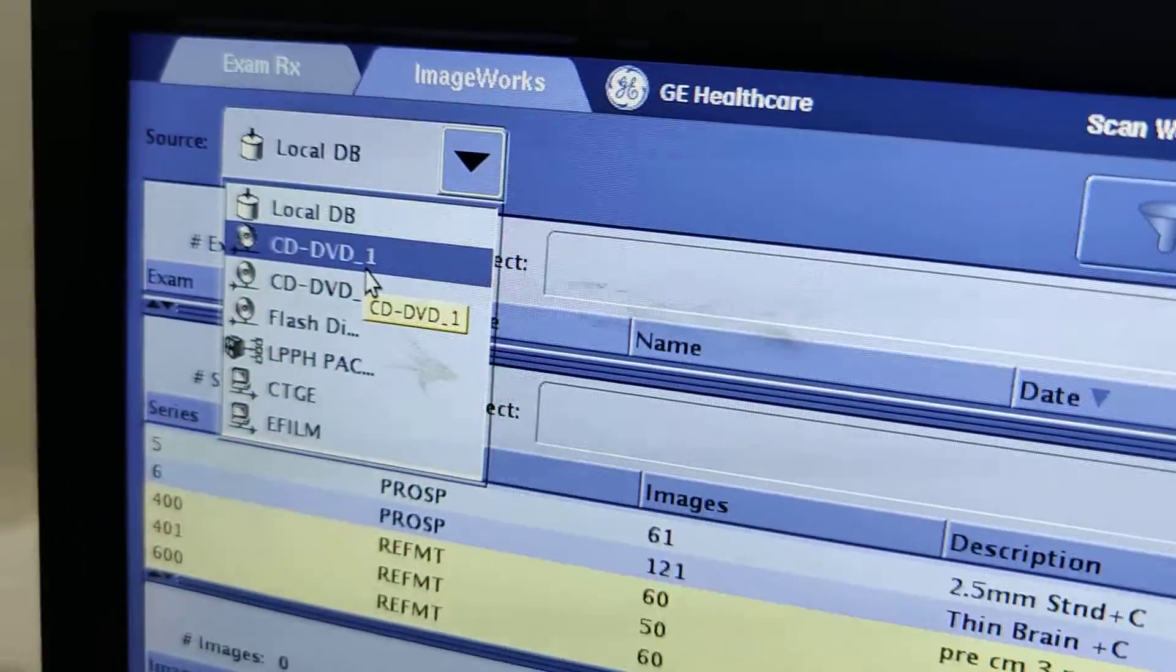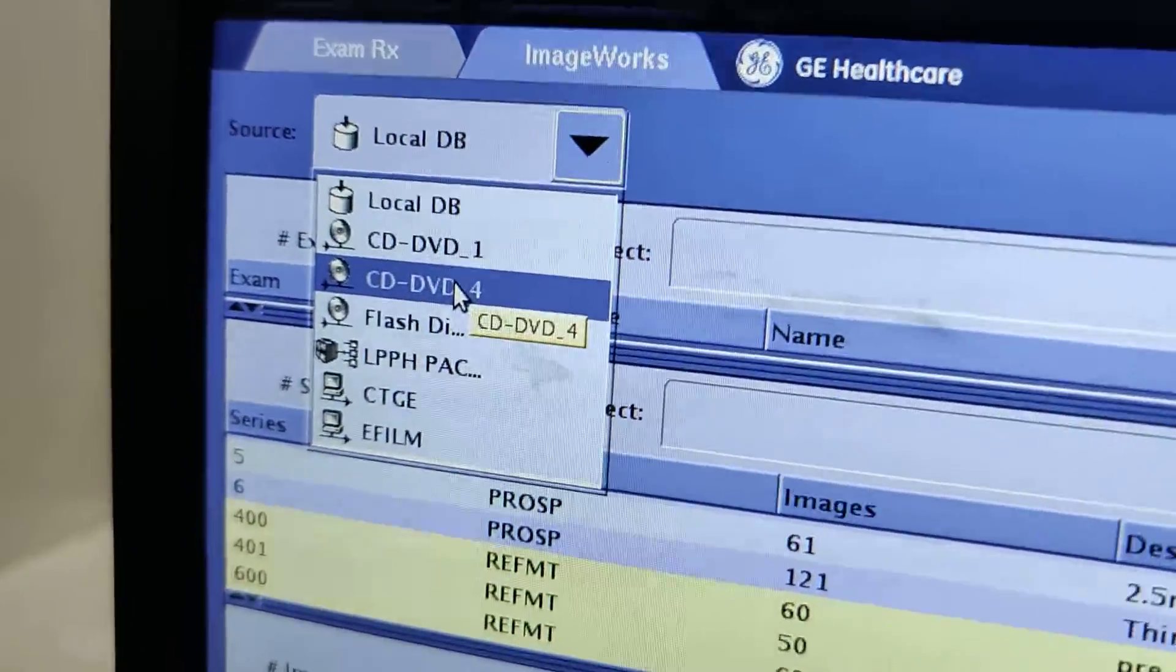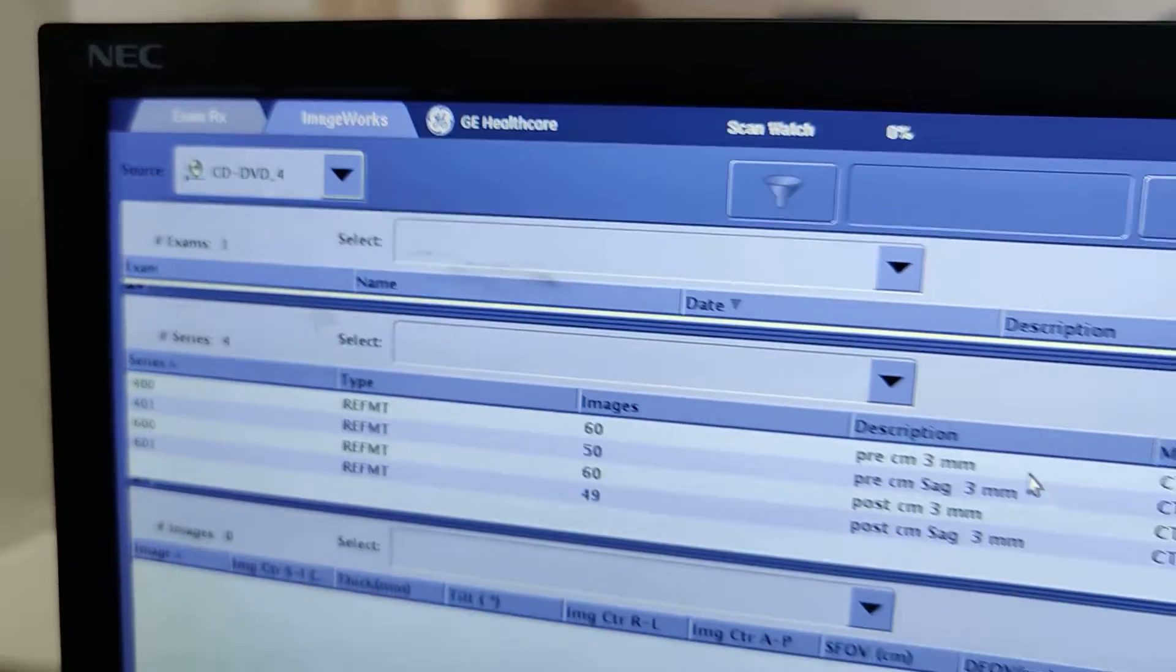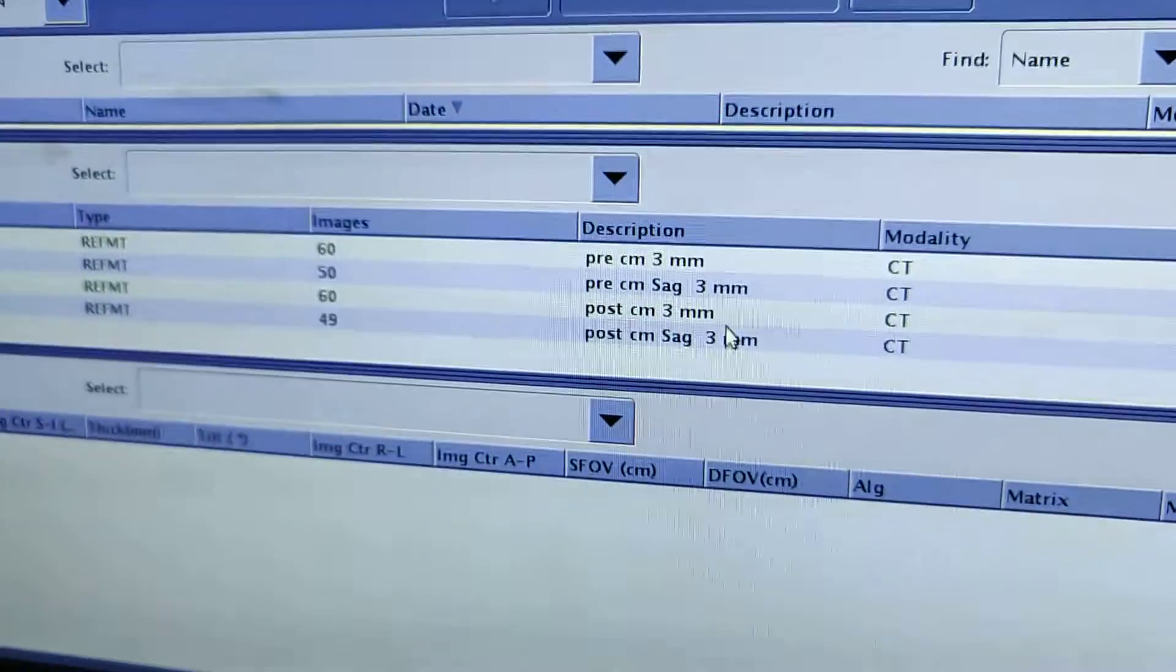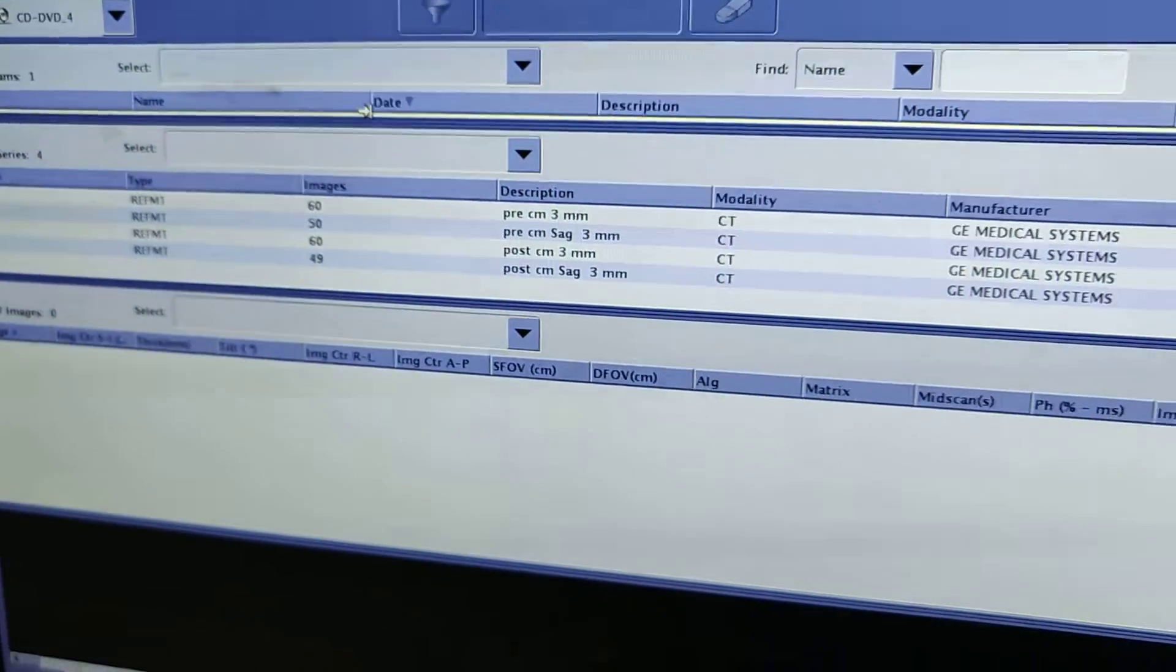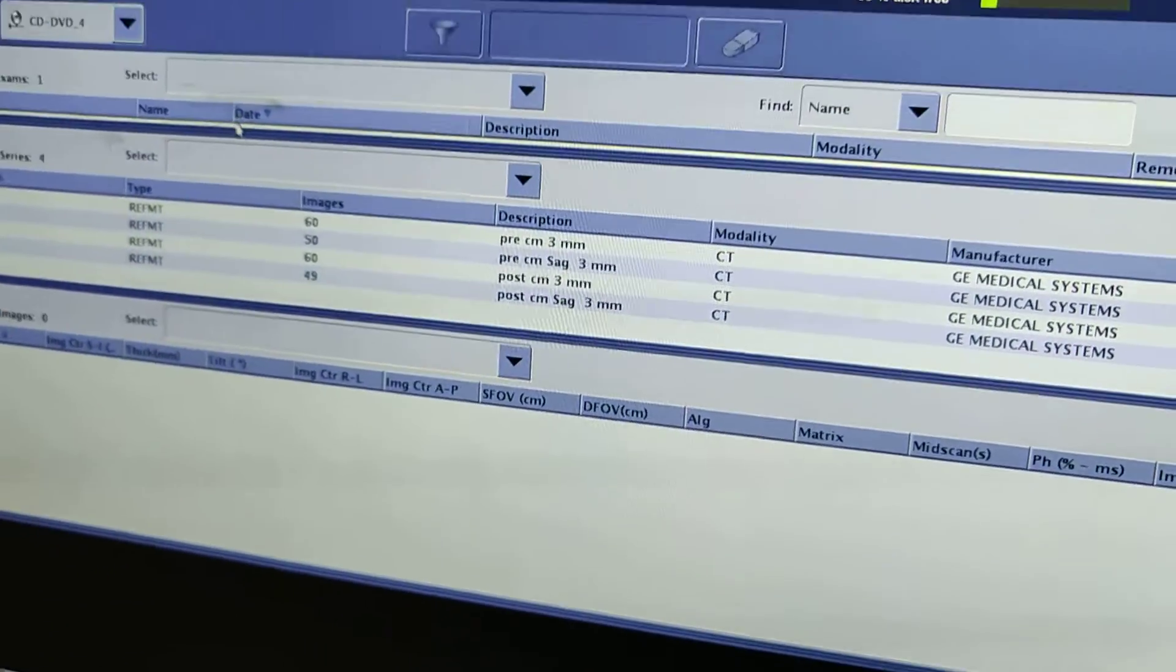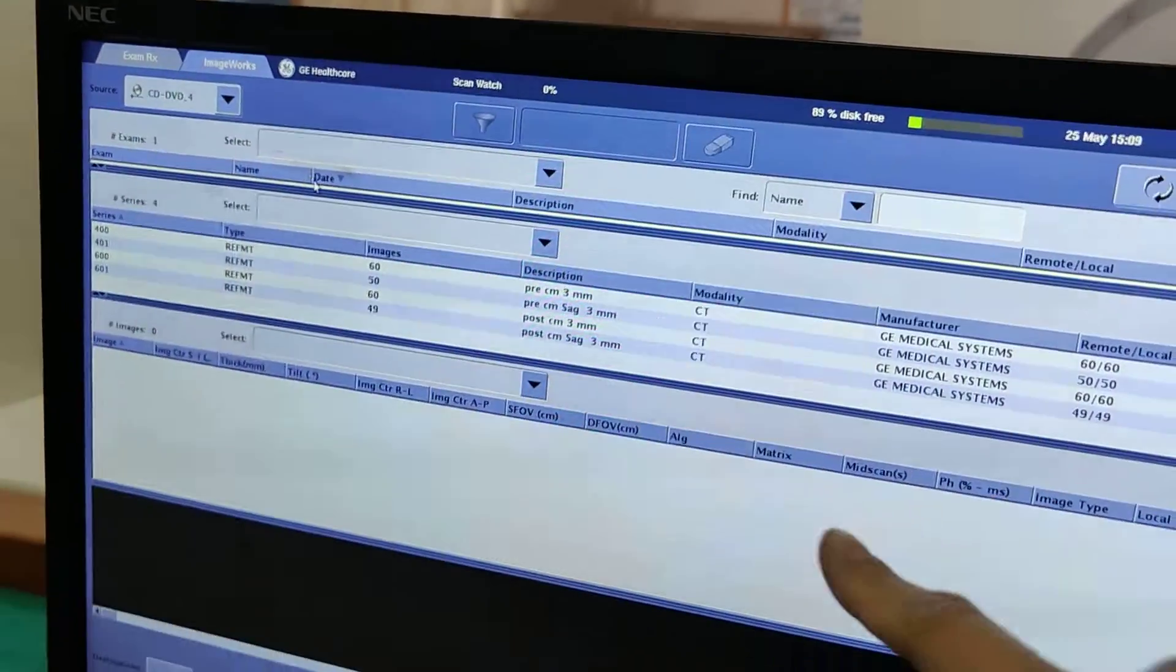You're going to go to the top left corner where it says local DB database, go down to the file name, and then the name of the patient will pop up, but then also you'll see all the stuff that we put on there.